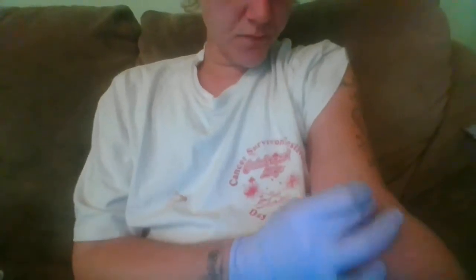And then I will slowly apply the butterfly needle. From what I know, which I'm not exactly sure, I think around a 21 gauge needle is normally good for drawing blood. So we'll just make sure that we put it in to where you're not going too deep. You're just going into the vein and you're just going in just enough. Okay.